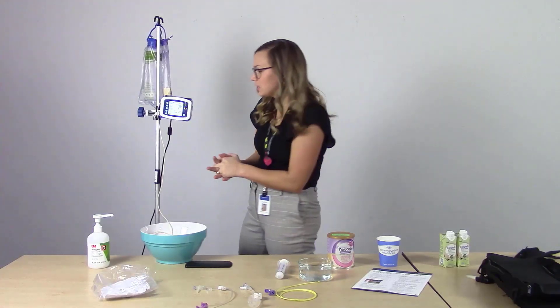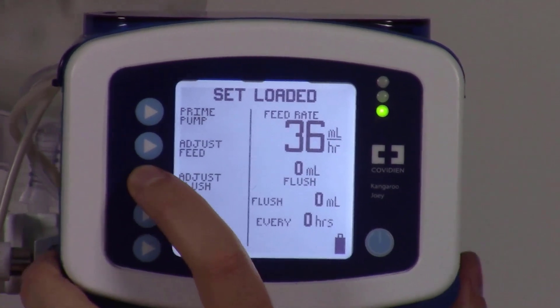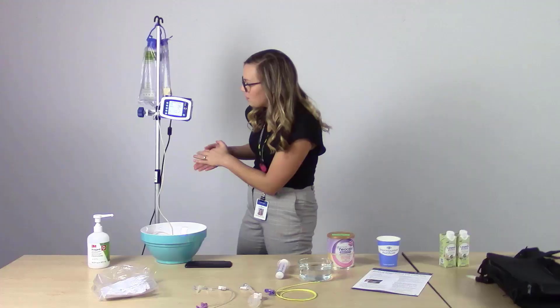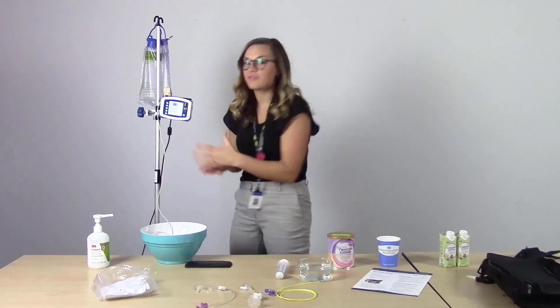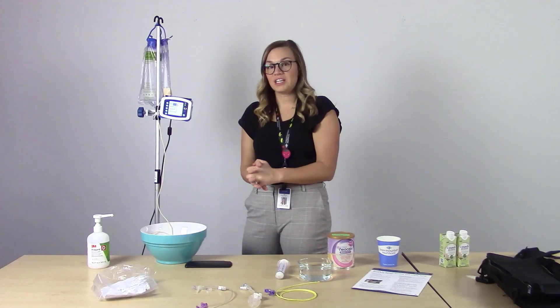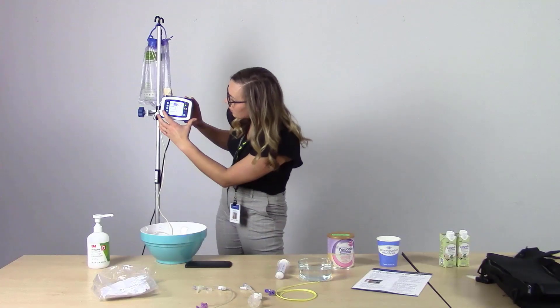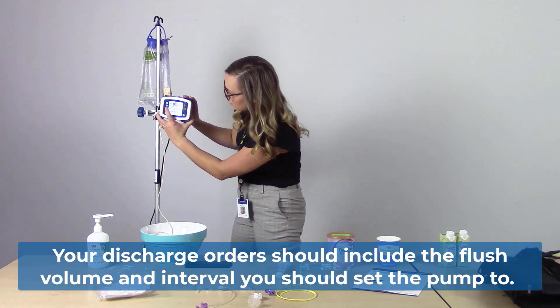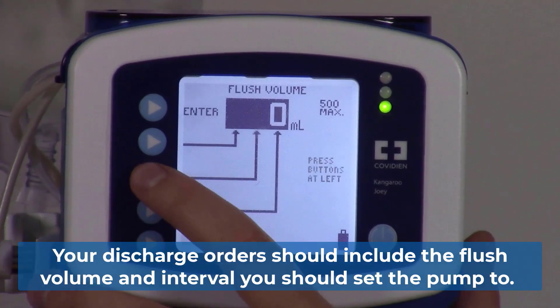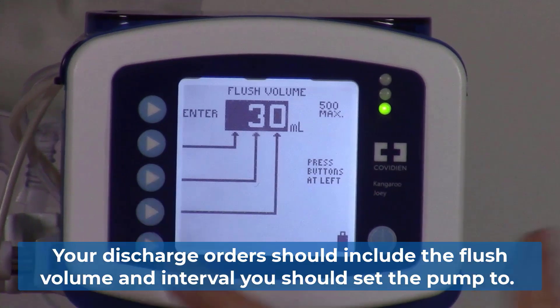The next button we'll need to press on the left is adjust flush. The first button is flush volume. For the purposes of our education, we are going to use 30 milliliters every four hours. We're going to set the flush to 30 mls using the buttons on the left that correspond to the place values. Press enter.